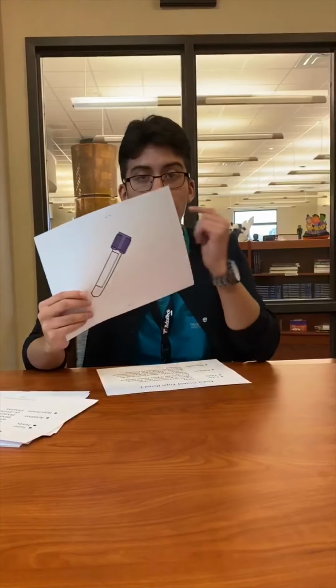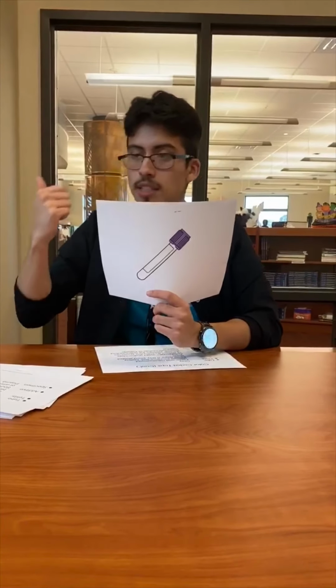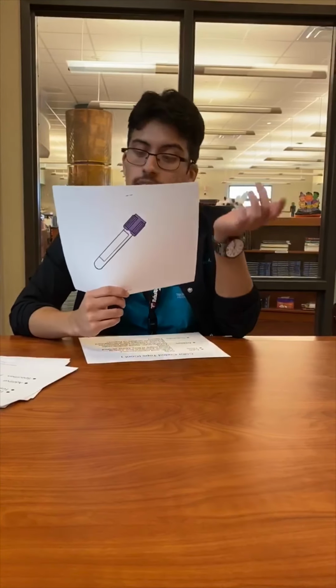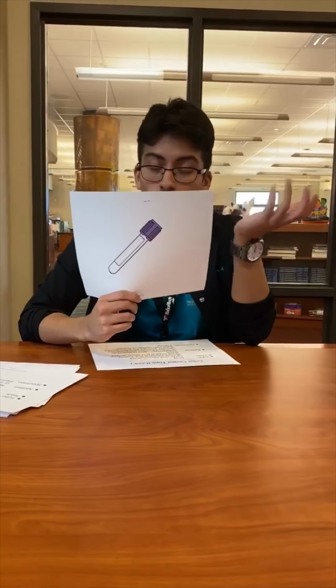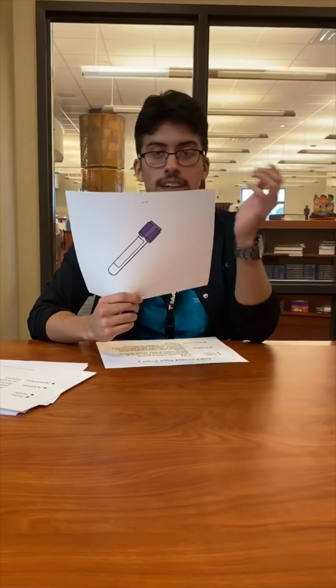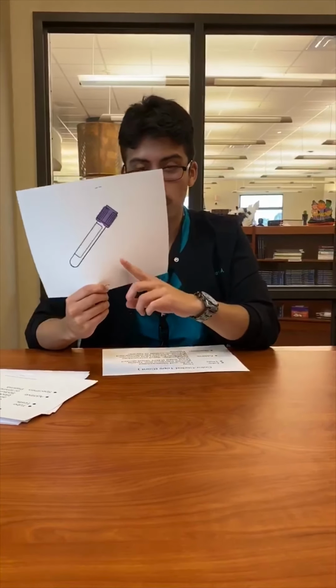Light, or lavender, as you can see here, is used to collect CBC, or complete blood counts, where it has white blood cells, red blood cells, and platelets. So those are really important. It also can measure your sedimentation rate and routine immunohematology, and the additive that it uses is an anticoagulant known as EDTA. Its specimen is whole blood. So, gotta be careful with that. This cannot be out more than 4 hours, and it's usually room temperature.